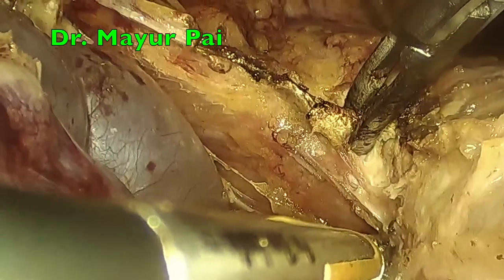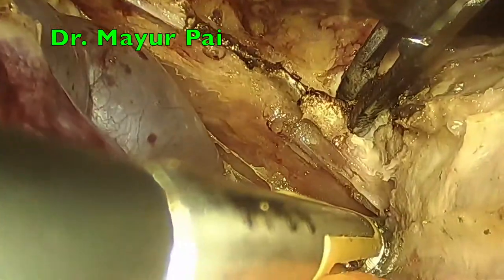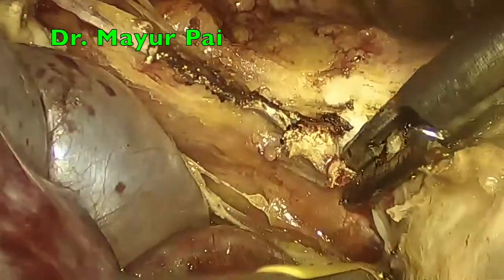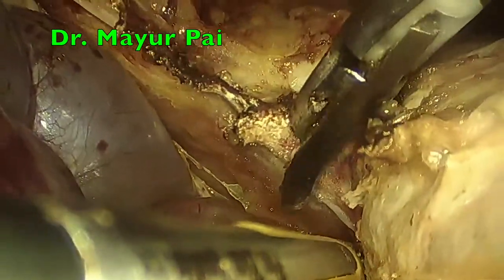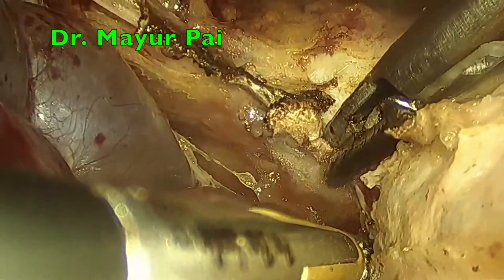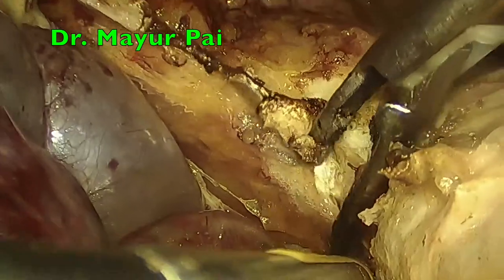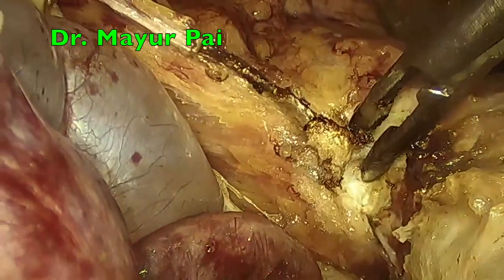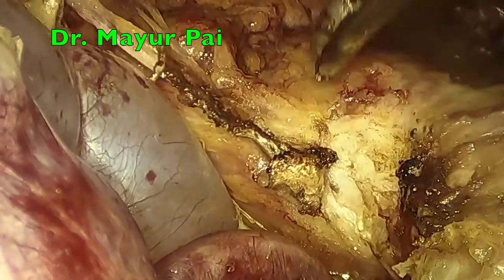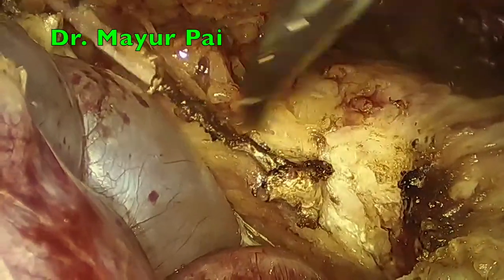Once the uterine artery and the vein bundle has been coagulated well and cut off, we try to lateralize it and move parallel to the cervix. And at the end of this step, you will realize that we have lateralized the entire bundle.